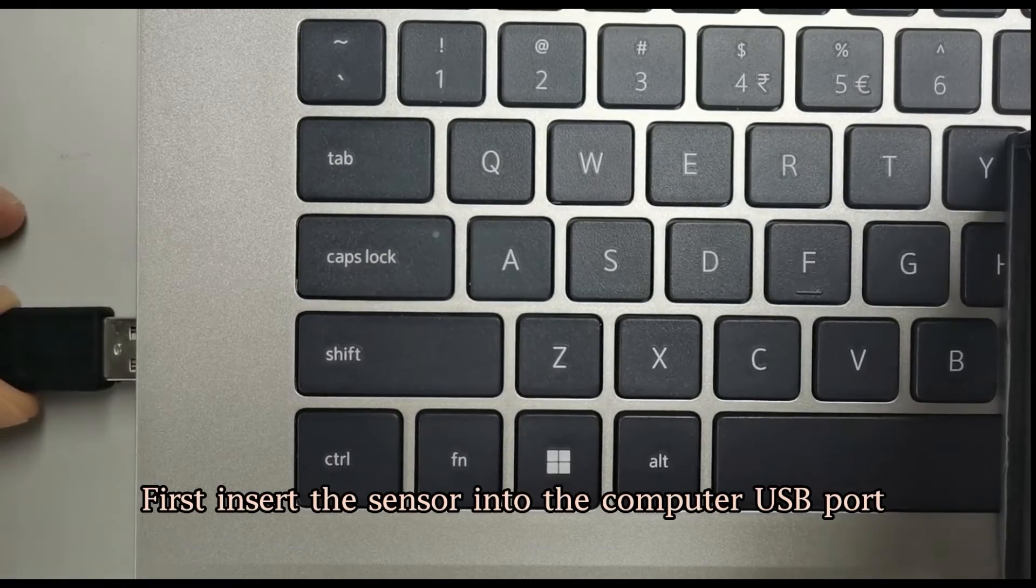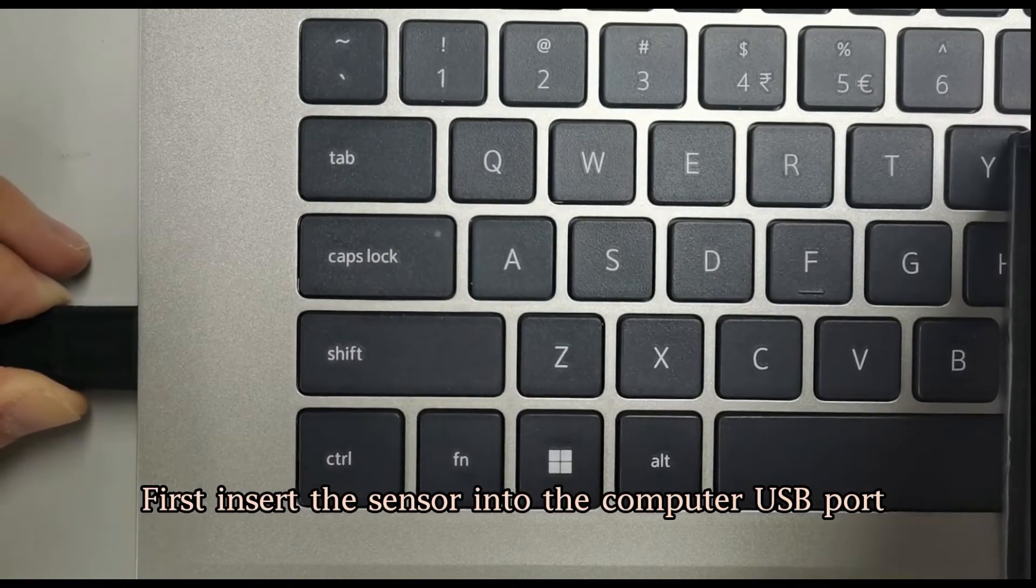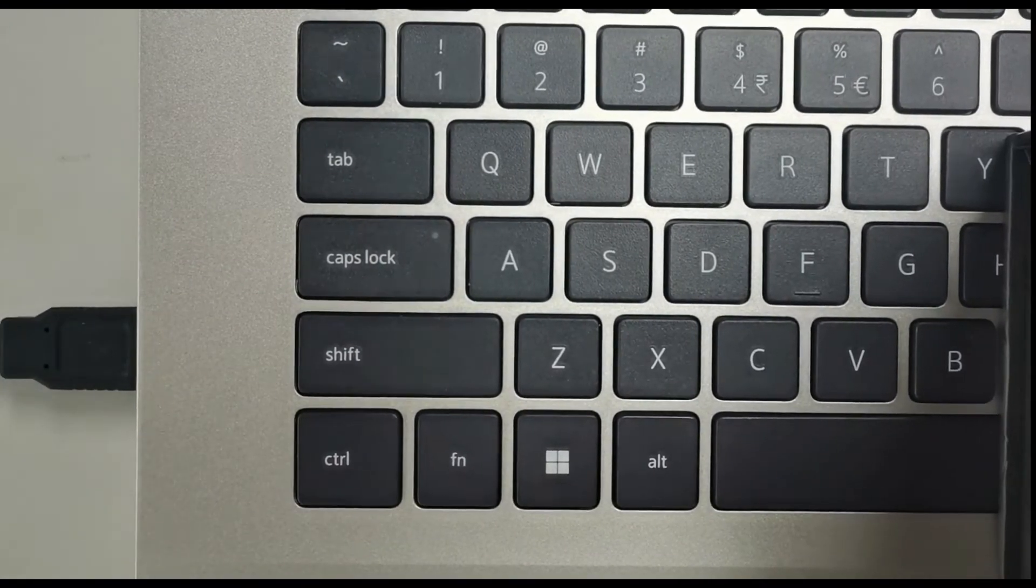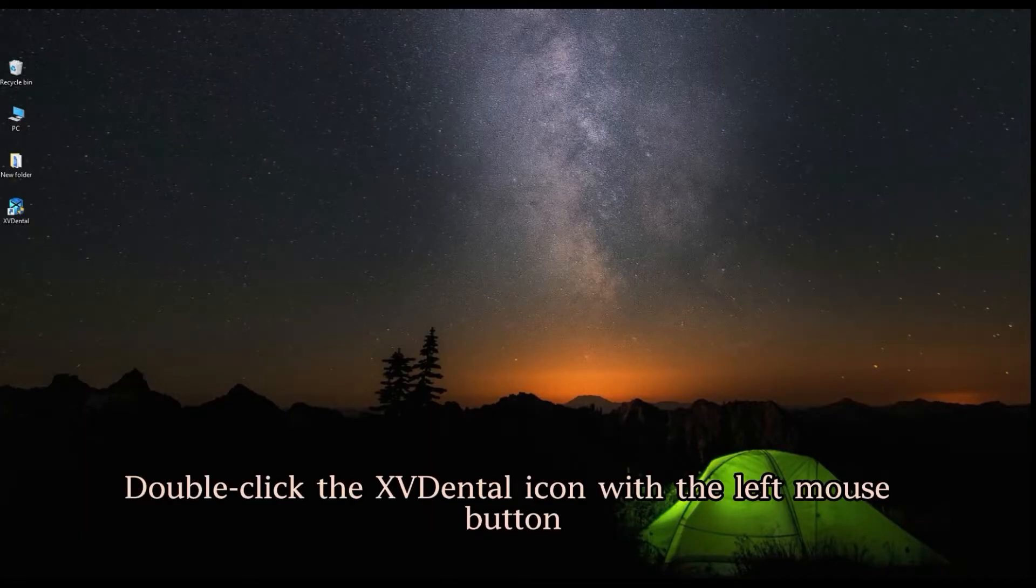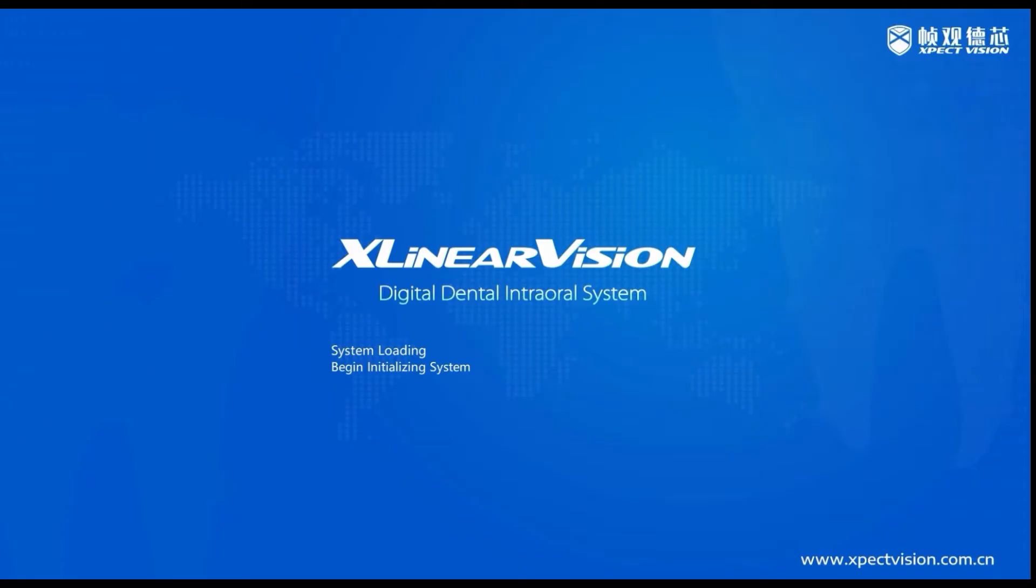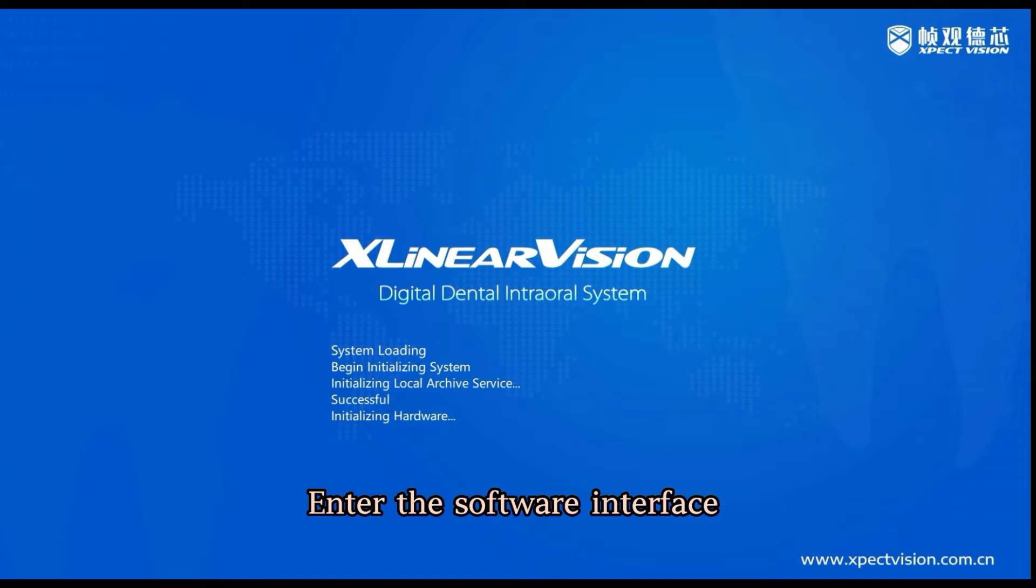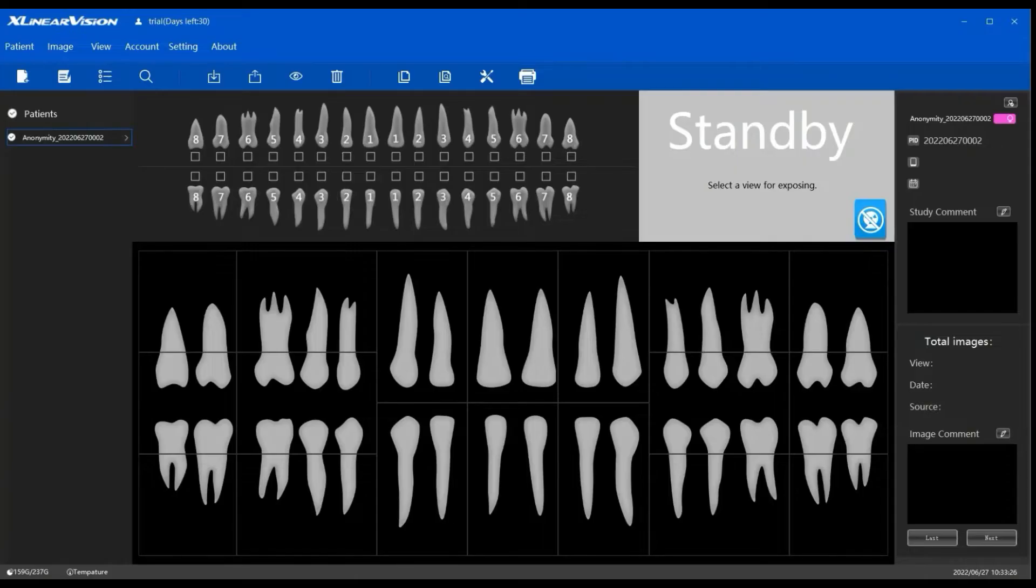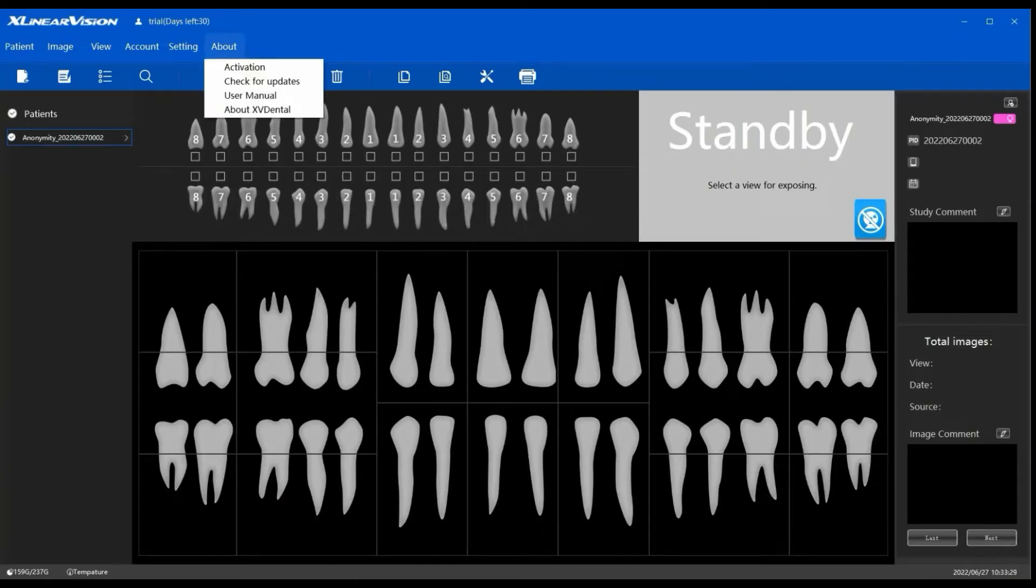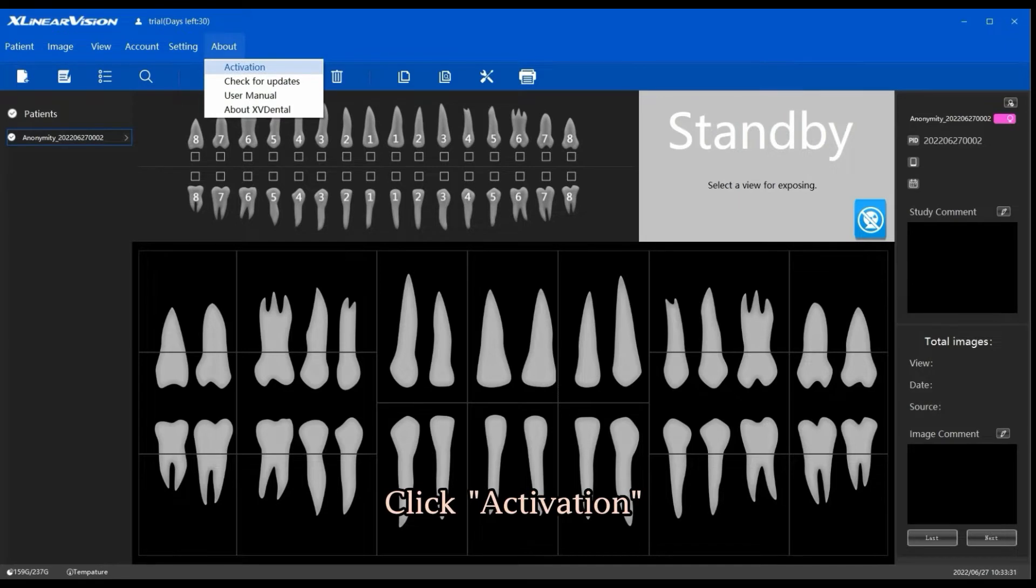First, insert the sensor into the computer USB port. Double-click the XVDental icon with the left mouse button to enter the software interface. Select About from the menu bar and click Activation.